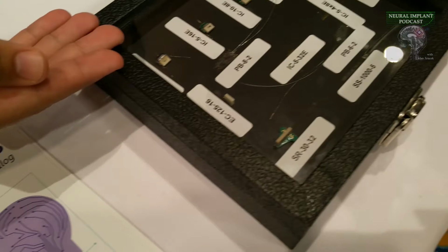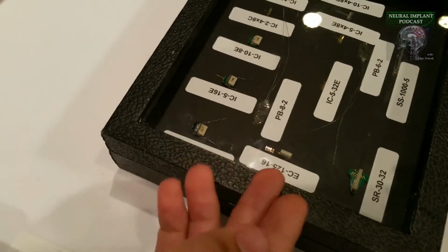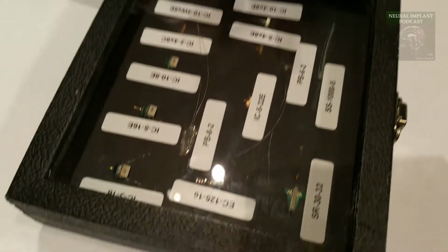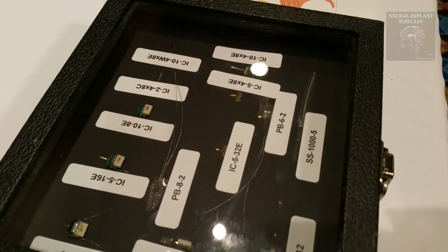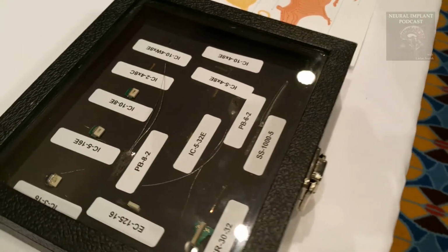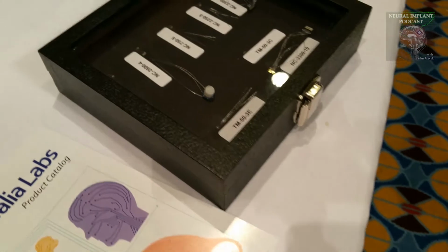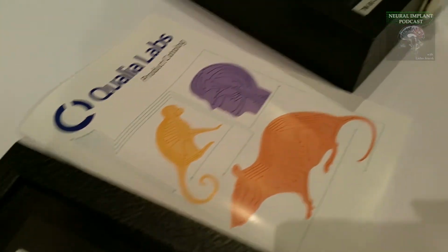And so what are these other devices then? So we have devices here from all of our different collaborators. We have some cortical probes up here at the top of all different shank lengths, electrode count, shank designs. Over here we have our epicortical array that lays on top of the brain. We also have some plexus blankets, well, one plexus blanket right here and one right here. And then we have at the bottom our two spinal cord devices, a recorder and a stimulator. And these were all spun out of collaborations with other research labs across the nation. So we do make custom electrode designs as well. In this box over here, we have many of our cuffs, almost all of our different designs, but these can also be edited and changed slightly to fit specific needs as well.